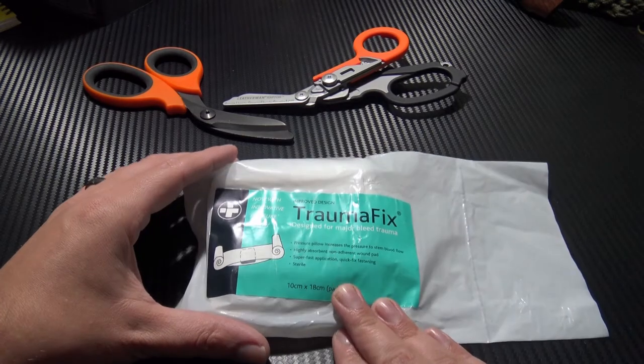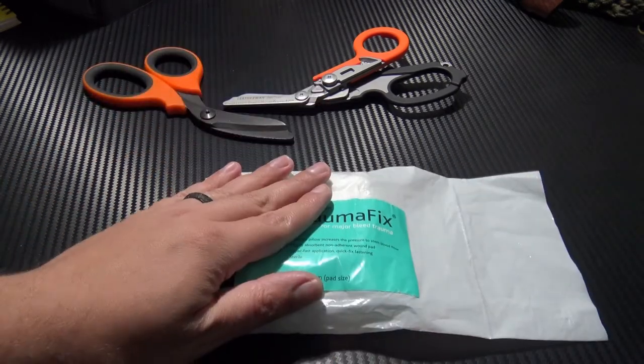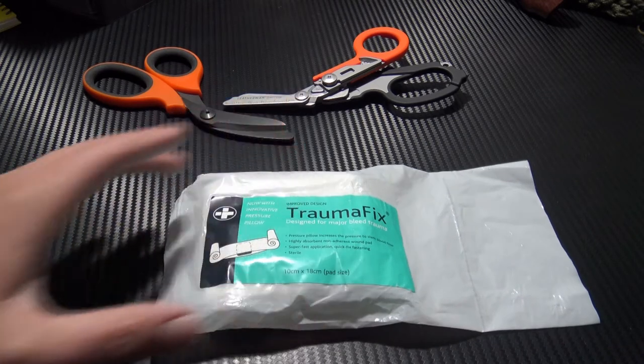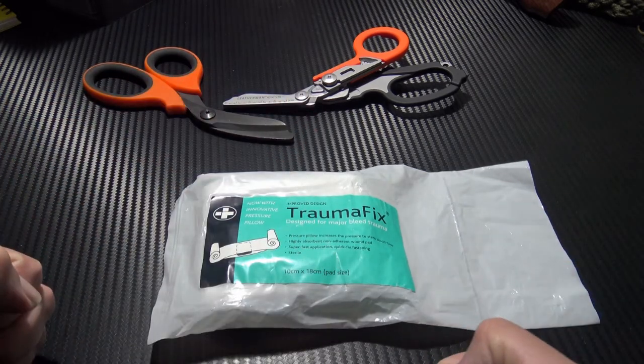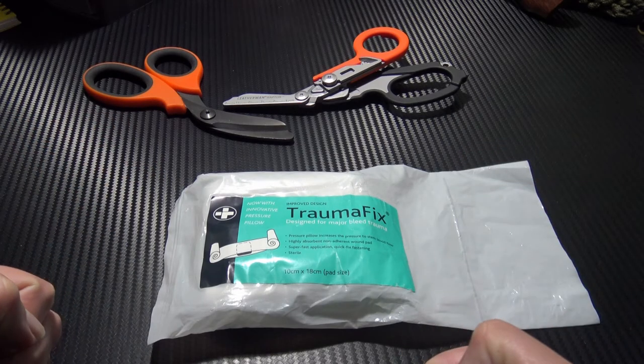It comes in a few different sizes. This particular one is 10 centimetres by 18 centimetres and it cost me £4.79. For £4.79, you can potentially save yourself or someone else's life.